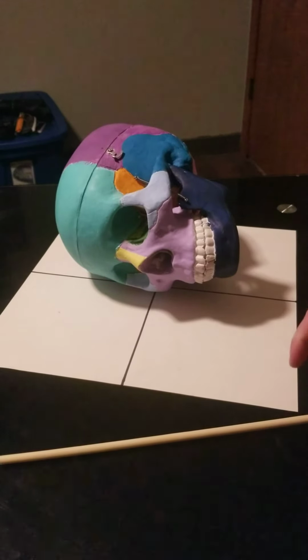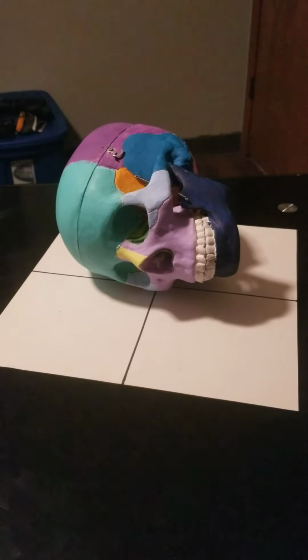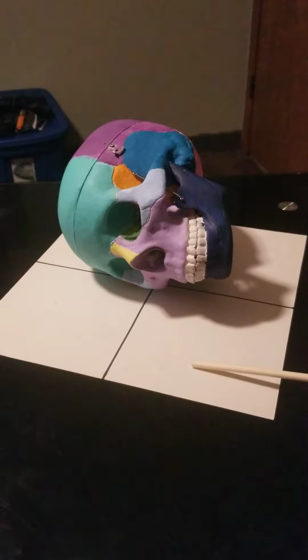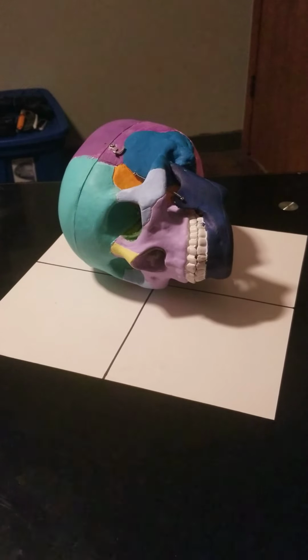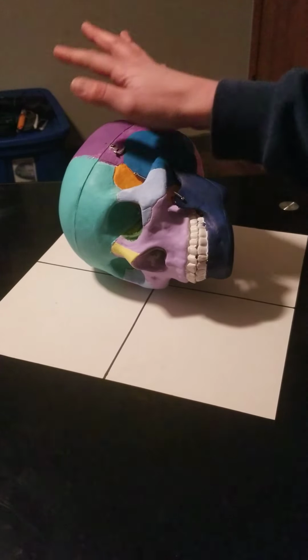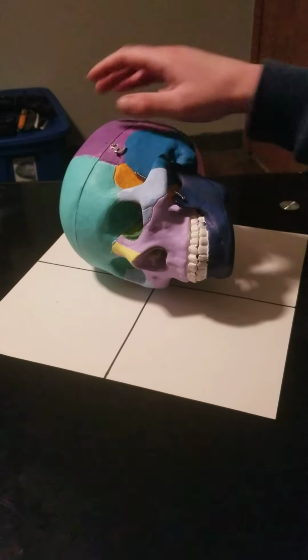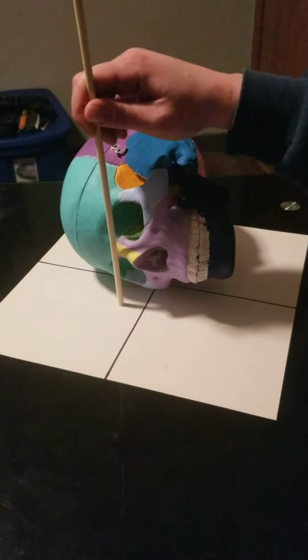My first projection is going to be my lateral facial bones projection. I'd want a 10 by 12 lengthwise IR. And I'd want my patient to be in the anterior oblique position with their head lateral. I'd want their MSP to be parallel to the IR and their IPL to be perpendicular.